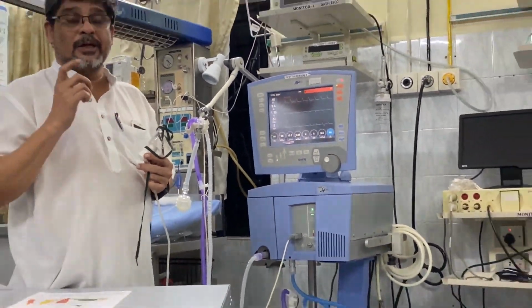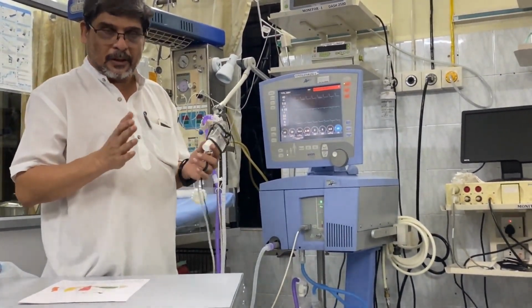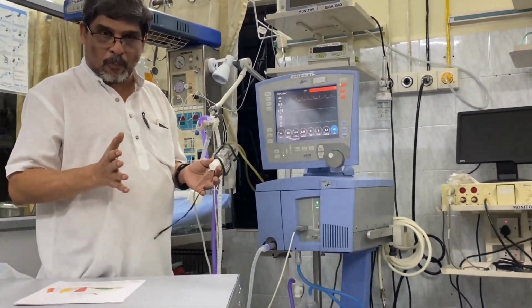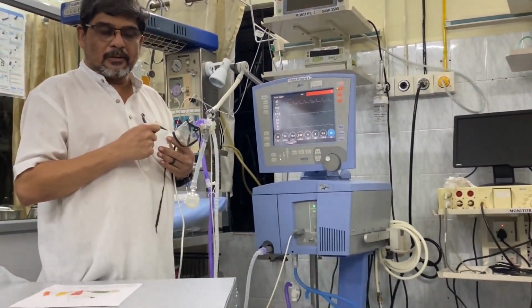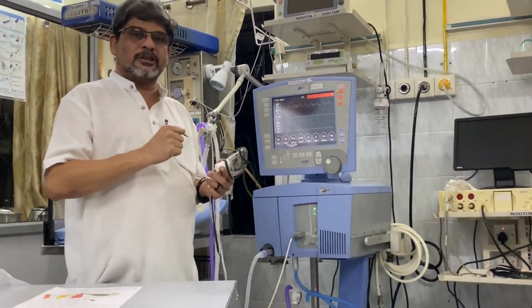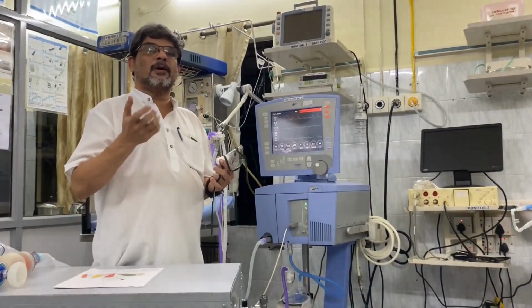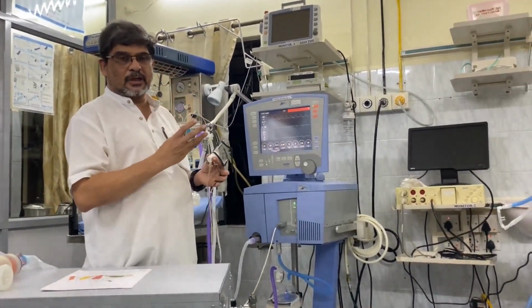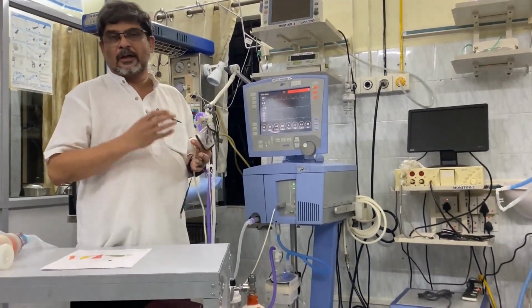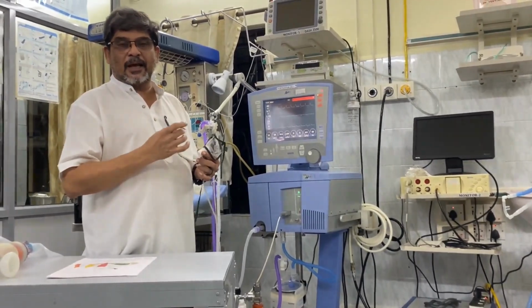The second way to increase the oxygenation is to prevent collapse of the lungs and keep them opened up so that there is good gas exchange. You can force the oxygen into the lungs and help the diffusion of oxygen by giving a pressure. So there are two ways to increase oxygenation. One is by increasing the concentration of oxygen which you are giving to the patient. Second thing is the pressure, mean airway pressure.